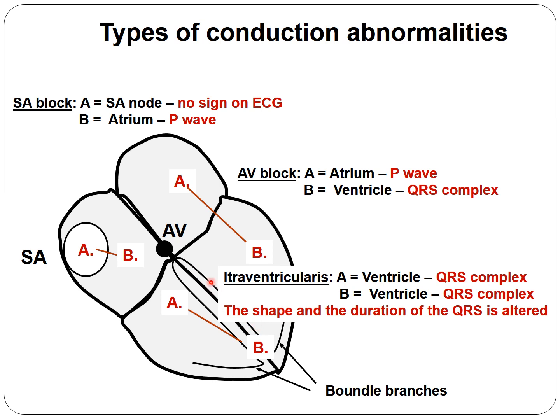Intraventricularly, when we have the bundles, these bundles can be blocked or can conduct the impulse slower. Whatever is going to be altered, it is usually the QRS complex, the width of the QRS complex and the shape of the QRS complex.